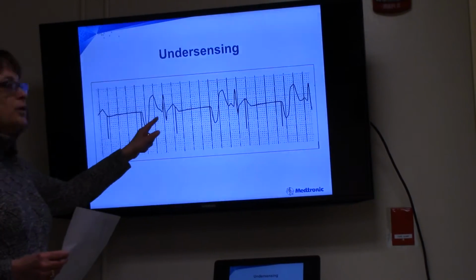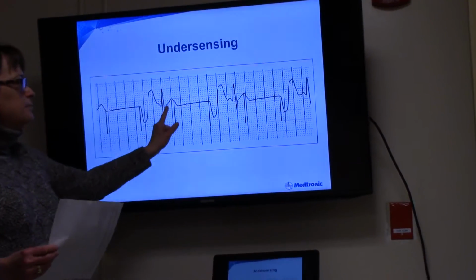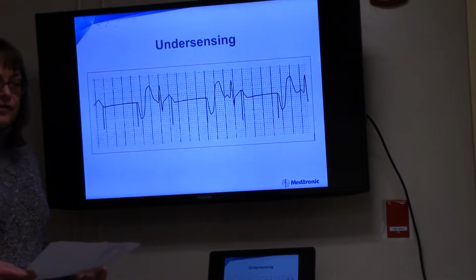So you would lower the sensitivity number. Can you see that right there? It says sensitivity. Now I'm seeing these beats and I'm not pacing after them anymore.